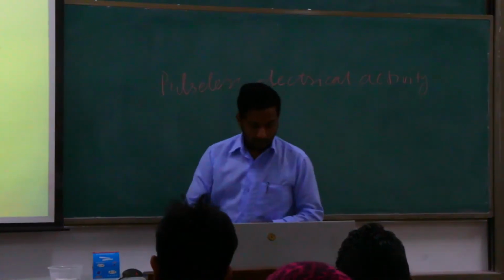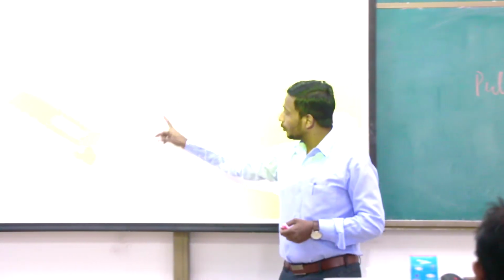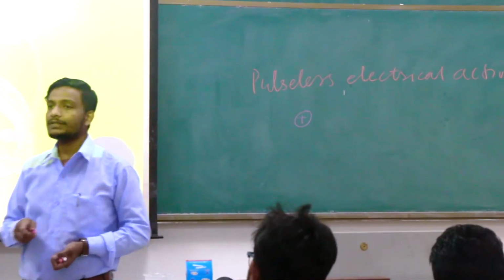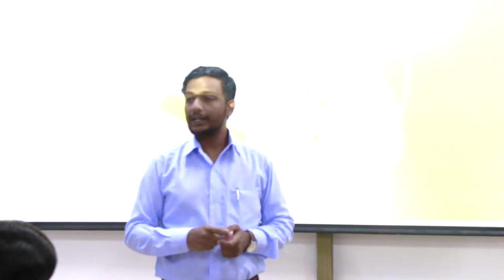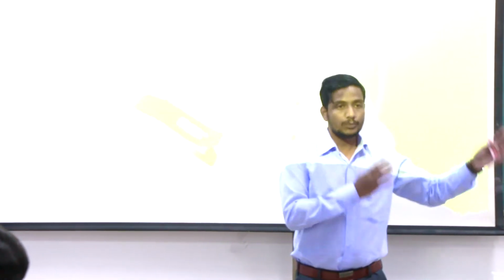Now, whenever we talk about the electrodes, you have to remember that when they are working alone, they always behave as a positive electrode. But when they work in a group, it has already been decided in the machine which one is going to work as negative and which one as positive.